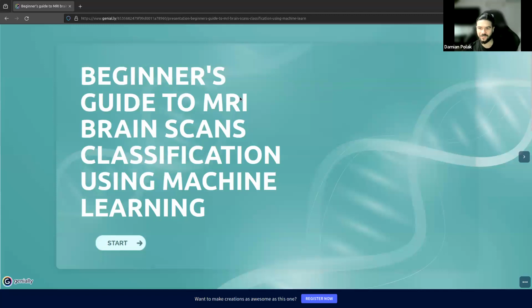Thank you. Hello, everyone. Welcome to my tutorial. My name is Damian, and I'm a machine learning engineer from Poland. Most of my work revolves around computer vision and deep learning. Today, I will be talking about working with MRI brain scans using machine learning techniques.